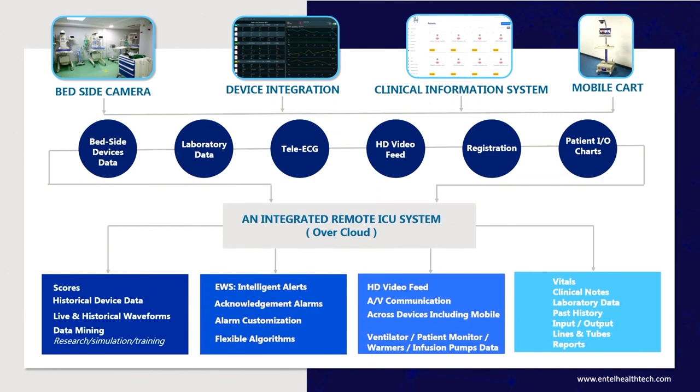So you have all data available. In addition, there is laboratory data. You have the patient's IO chart, which is getting automated. So the one-hourly chart is updated. Practically, all the data available at the bedside is available at the command center.